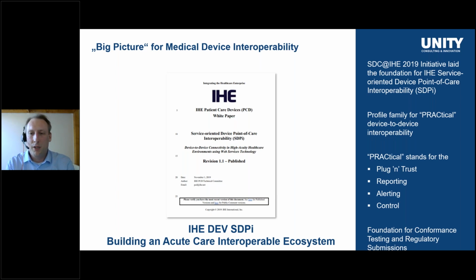And of course, IHE also addresses a lot of healthcare IT companies that maybe are not the classical medical device vendors. Moreover, and that is one big aspect here as well, IHE also provides a nice conformance assessment scheme, which can be used to test conformance for interoperability standards. This is what we would like to use to clear the regulatory pathway, as I just mentioned before, and to allow a vendor to demonstrate conformance by going through this conformity assessment based on the IHE technical framework SD-PI.